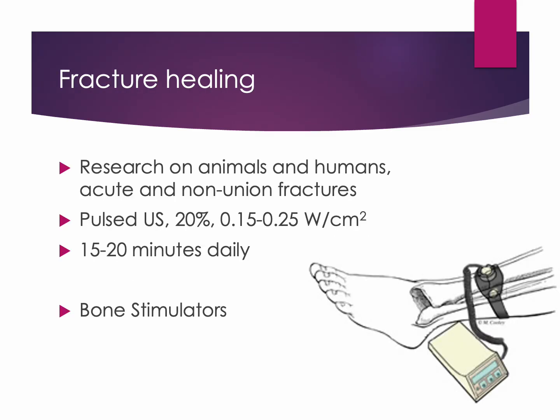Pulsed ultrasound has also been shown to assist with fracture healing, particularly in non-union cases when applied daily at low intensities. Pulsed ultrasound, particularly low-intensity pulsed ultrasound, has been used to promote fracture healing through non-thermal mechanical effects that may stimulate cellular activity involved in bone repair.